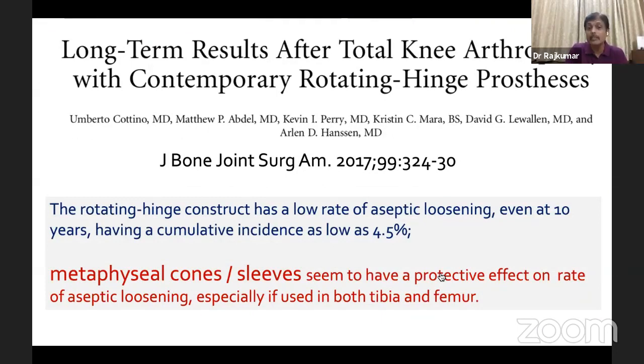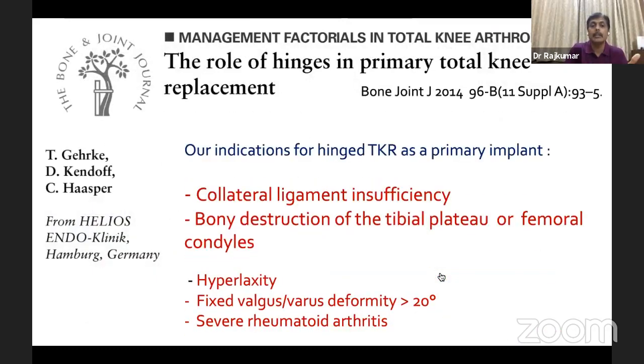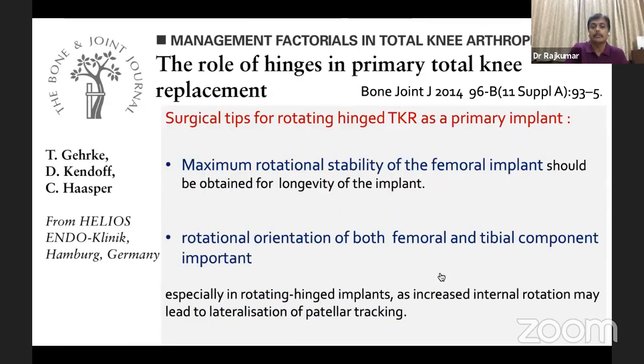Why? Because of the advanced hinge process. These failures were very high in the old systems, but in the recent ones, the advantage of metaphyseal cones or sleeves seems to have a protective effect on the rate of aseptic loosening. From the endoclinic paper, they have very clearly mentioned the indications: collateral ligament insufficiency and bony destruction of the tibial plateau, hyperlaxity, fixed valgus, and severe rheumatoid. In this paper they have quoted old age patients, but there are reports in younger age also where the rotating hinge is doing well.